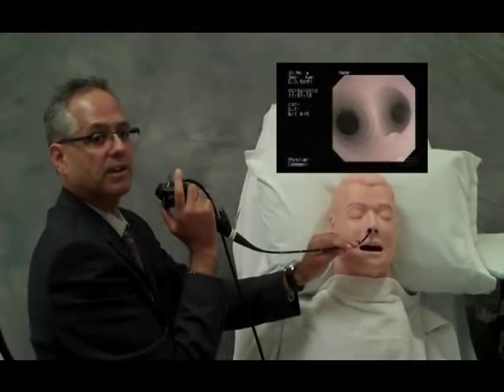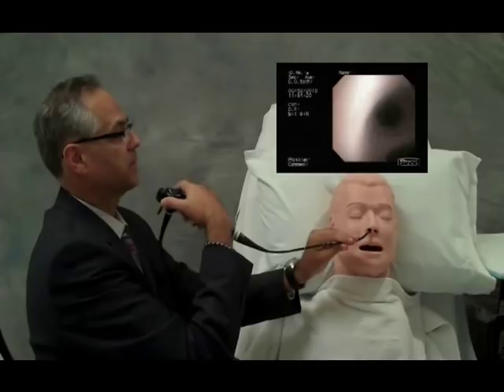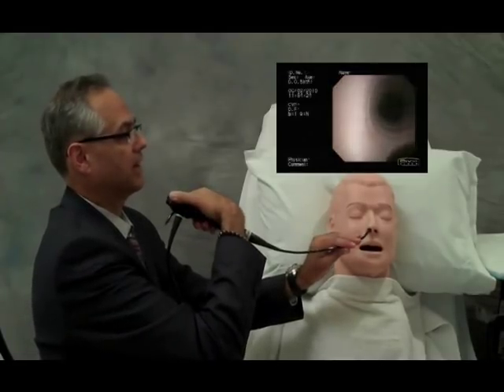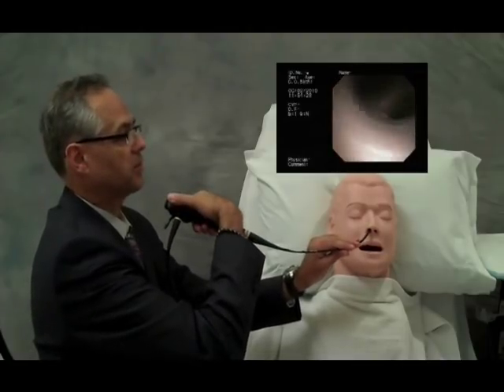Step 4 is the right-left exercise at the level of the carina. The scope can be rotated as we look at the right main bronchus and the left main bronchus, the right main bronchus and the left main bronchus.